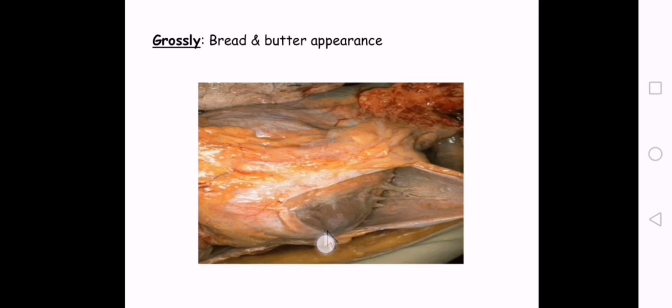هذا البريد اند باتر. وقلت تذكرون قلت لكم لما توست نخلي عليه باتر ونطبق التوست الثاني عليه ونوخره يشبه هاي الصورة، فشبهوها بالبريد اند باتر appearance. هي هاي الرف surface of fibrinous deposition.